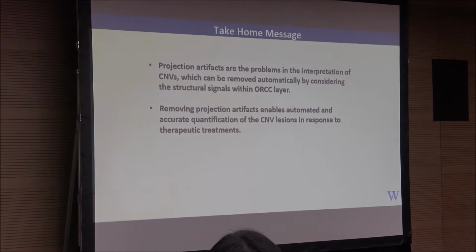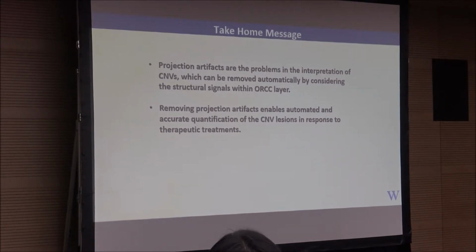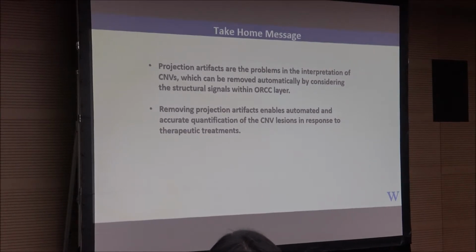And so this really needs to be removed in order for you to quantify the CNVs.